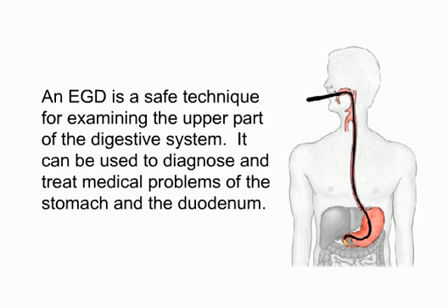Conclusion. An EGD is a safe technique for examining the upper part of the digestive system. It can be used to diagnose and treat medical problems of the stomach and the duodenum.